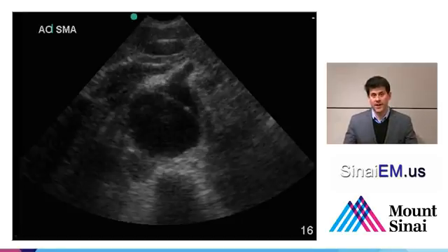Bedside sonography has a high sensitivity and specificity for ruling in or out abdominal aortic aneurysm. It's an excellent test for that. It's not as sensitive, although it's reasonably specific, for visualizing aortic dissection. So if that's in your differential and you don't see it on point-of-care sonography, consider other studies like a radiology CT scan, MRI, depending on what the clinical scenario is for your patient.